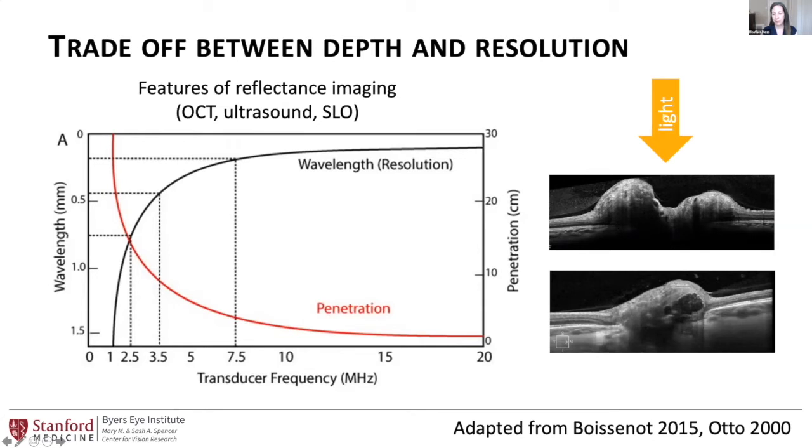So you can see here with this papilledema, the swollen nerve, that the back of it is shadowed because the light can't penetrate to image what's back here. You can see in this drusen nerve that's a little less swollen, you penetrate a little bit more, but even in the center here, you can't see back very well. And so it's hard to see what structurally is going on.